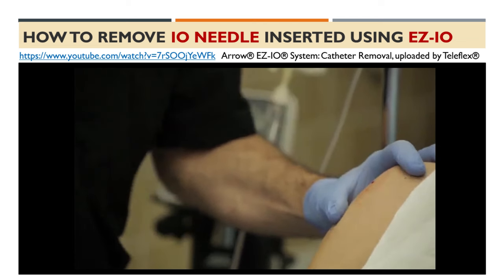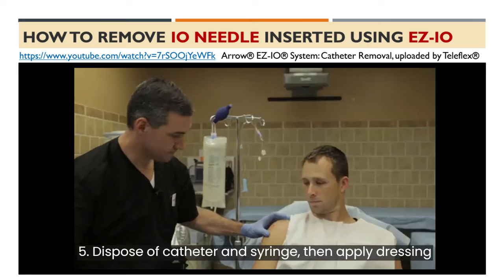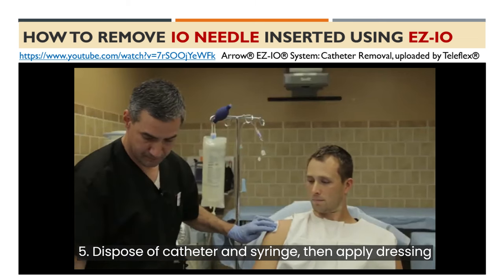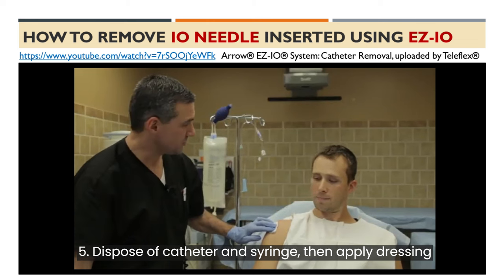Step 5: Dispose of the catheter and syringe in an approved sharps container and then apply dressing to the skin.